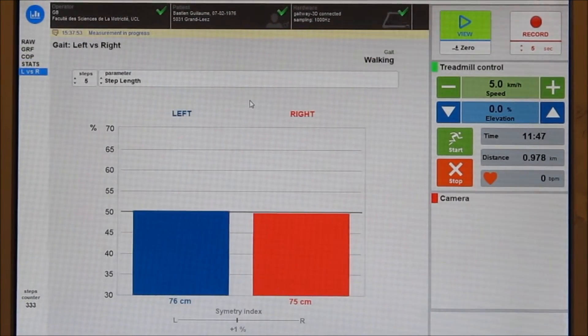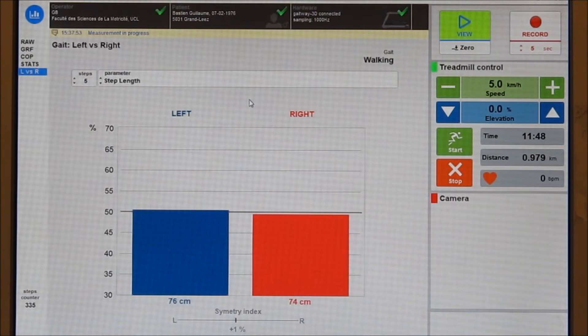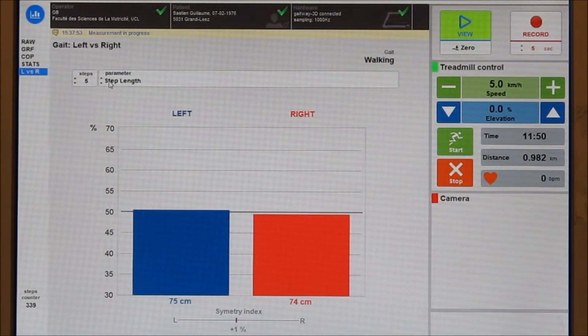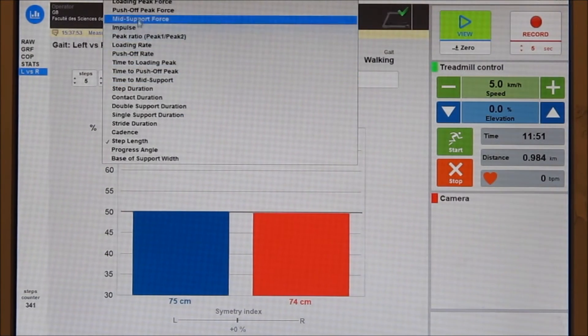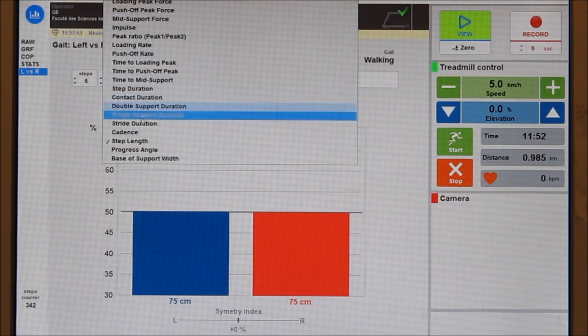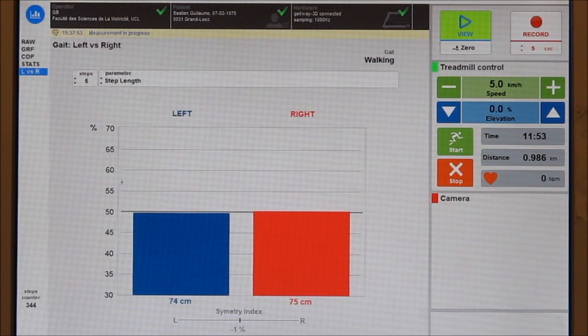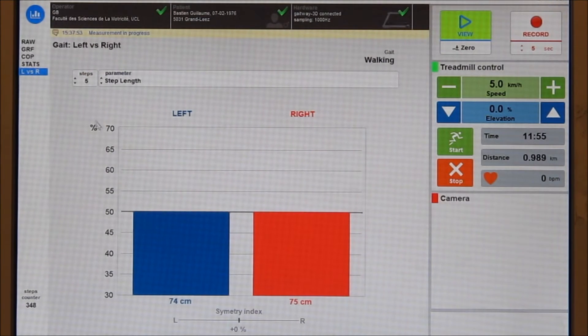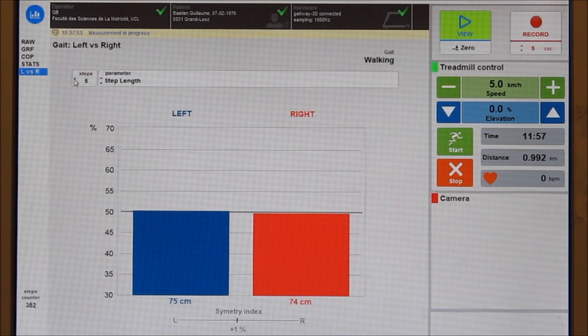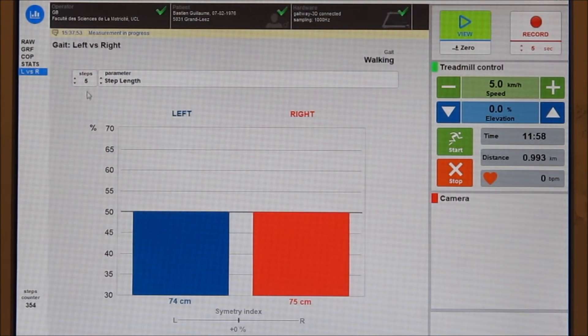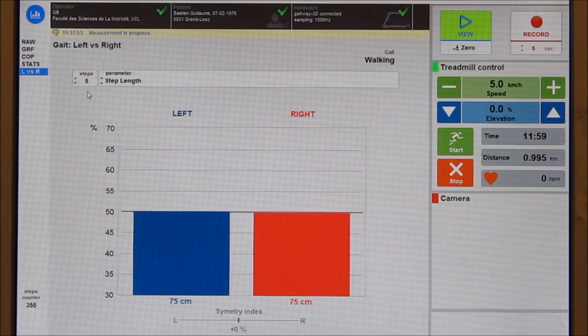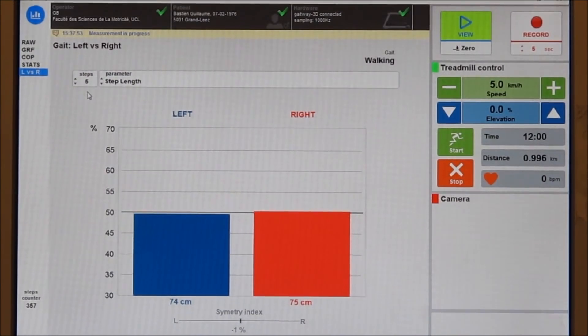The left-right screen is used to provide feedback to the operator or to the subject during the exercise. Any parameter can be displayed in a simple left versus right presentation. A symmetry index is also displayed in percentage of the average.